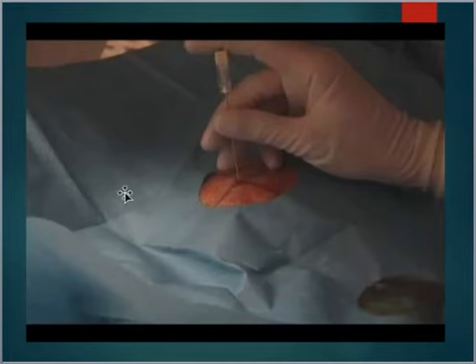And this is kind of a close-up of what it would look like as they're putting the needle in. Patients don't love these. They're actually fairly quick, fairly easy. They're not super painful. They use a lot of lidocaine, so it helps numb the area. They feel a little twinge when they get right through the joint, but other than that, most patients leave thinking it was better than they thought it was going to be.